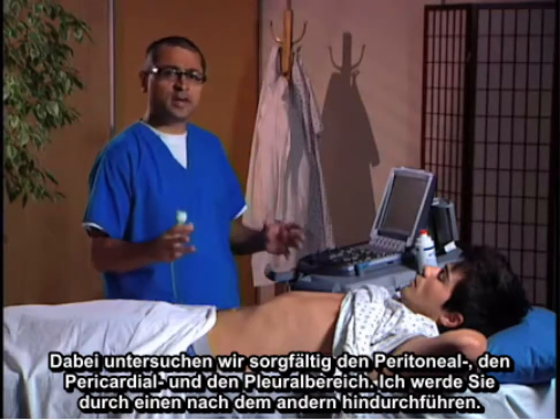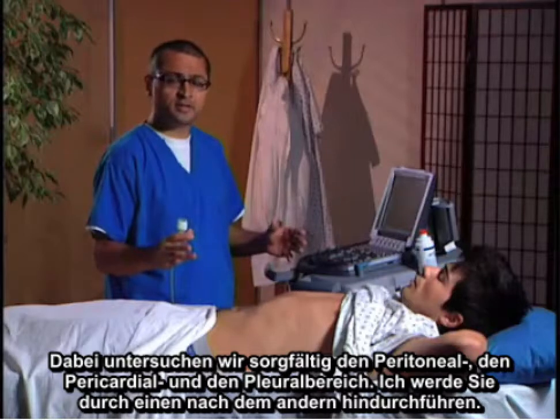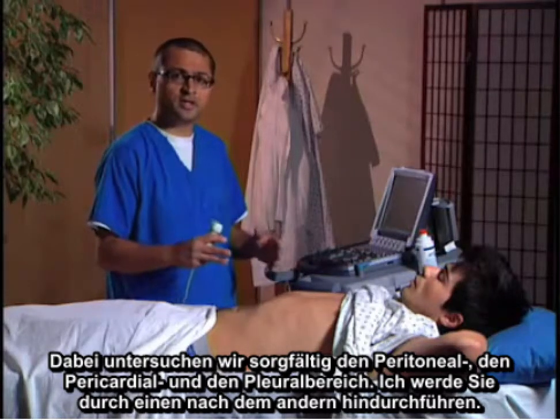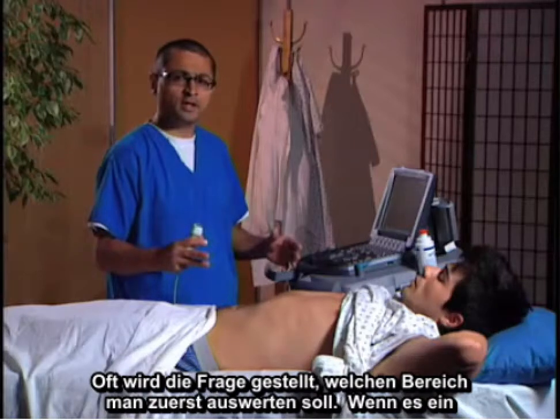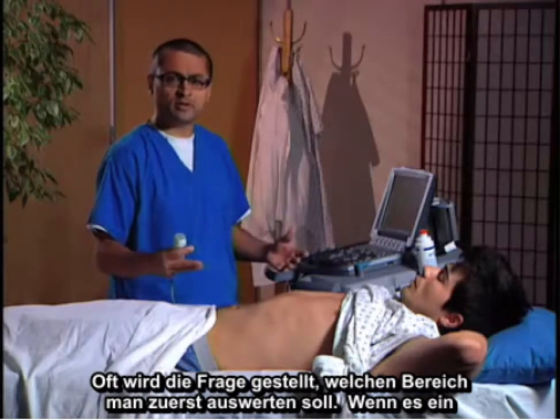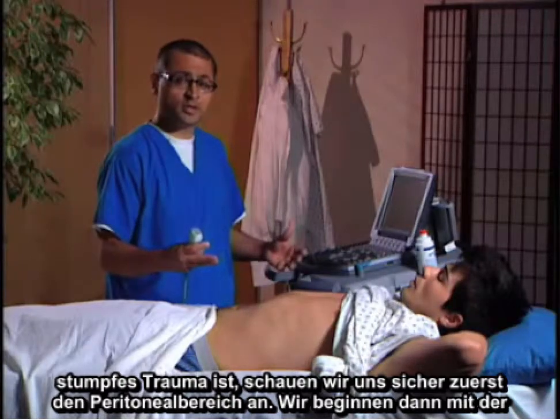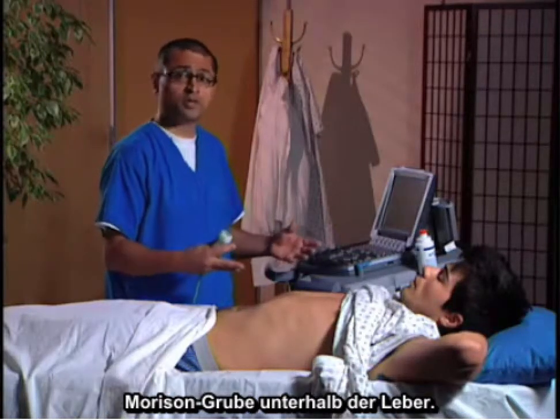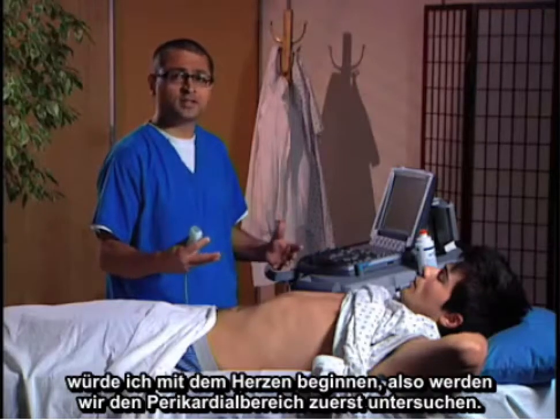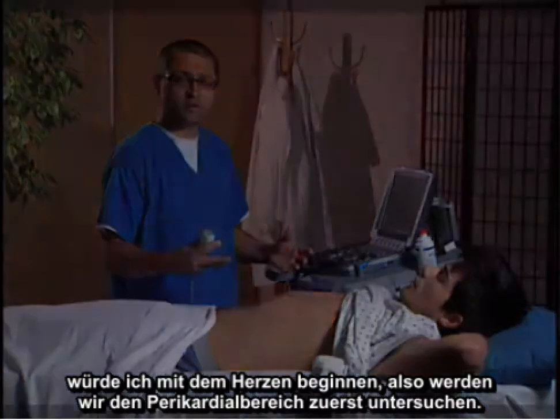The areas we're going to examine carefully are the peritoneal space, the pericardial space, and the pleural space. Often what comes up is which space to evaluate first. For blunt trauma, we're going to look at the peritoneal space first, starting at Morrison's pouch. For a penetrating injury, I like to start at the heart first, examining the pericardial space first.